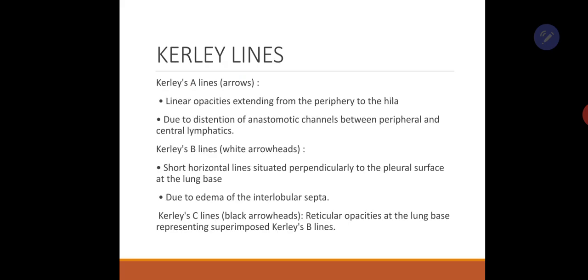What are Kerley lines? Kerley lines are very important. Kerley's A lines, Kerley's B lines, and Kerley's C lines. You should keep these in mind. At least you should know there are three lines, and I think A and B are very important. I'll show you the lines.